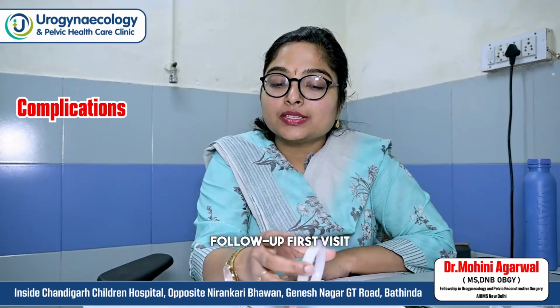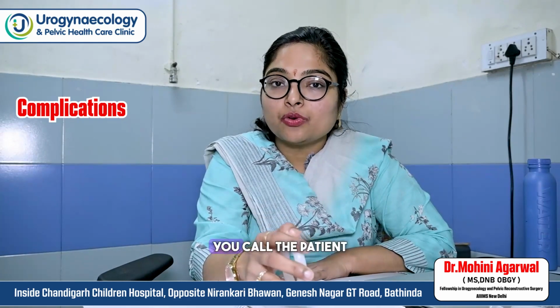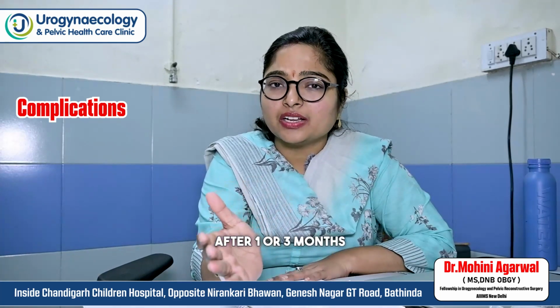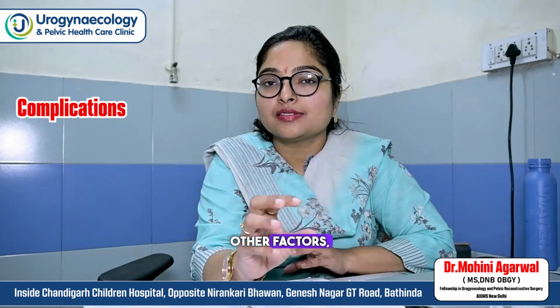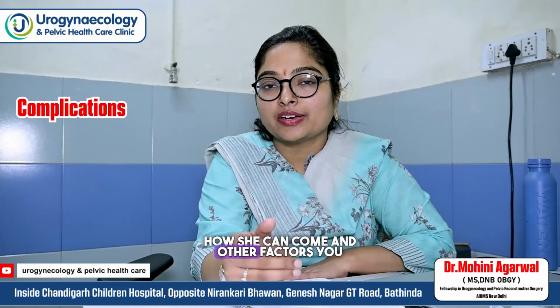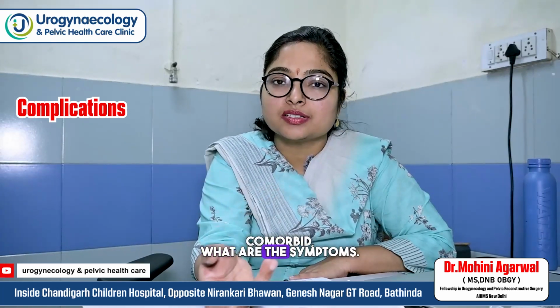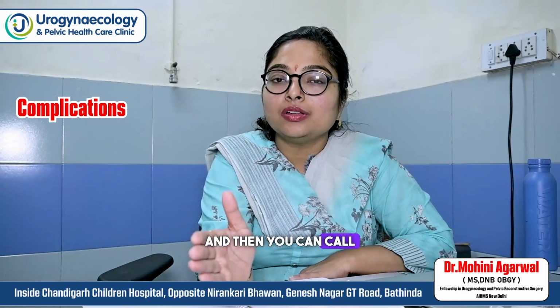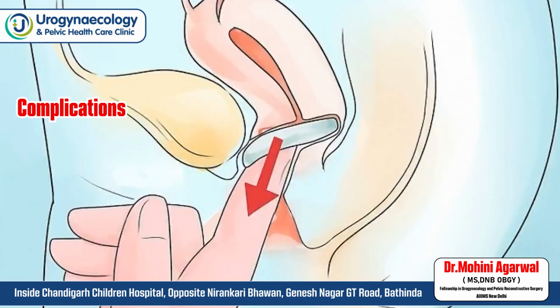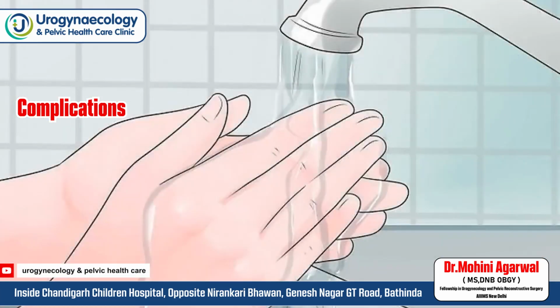Again, on follow up, first visit is within 2 weeks, as I said. Second visit, you call the patient after 1 or 3 months, and then every 6 months to annually, depending upon the patient, her symptoms, how she can come, other patient conditions, comorbidity. Ideally the pessary should be removed every day at night, washed and reinserted in the morning. But practically, some patients don't like to do that. So at least you teach the patient to do it weekly.